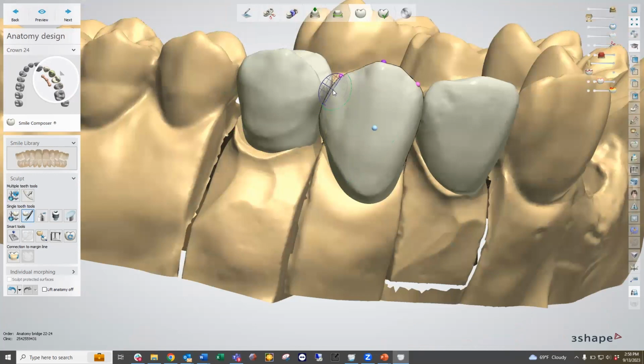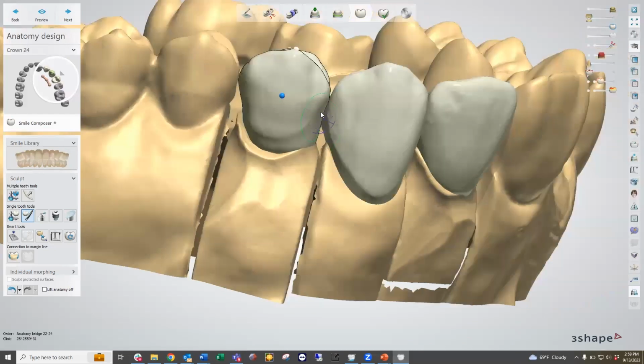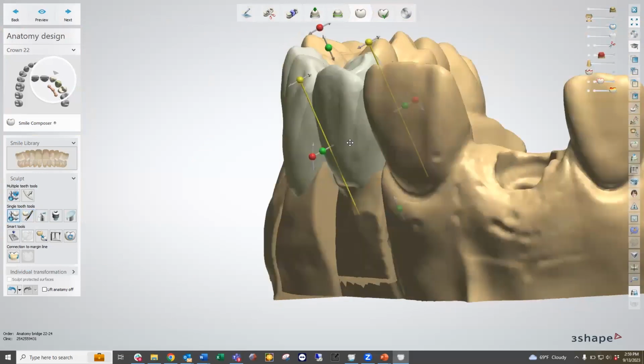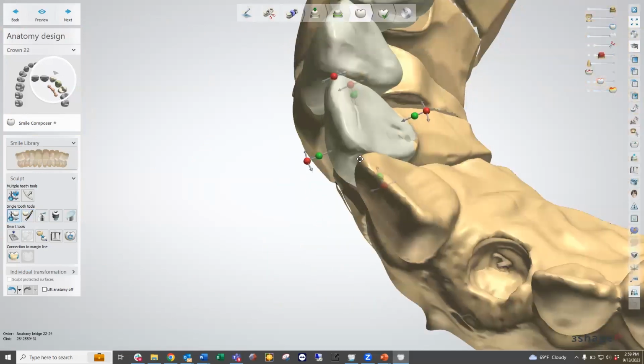So I'm going to develop this a little bit more with my medium change tool, or intermediate change tool, which is the morphing tool. This allows me to suck in or suck out certain areas of our design to encapsulate those median changes. Maybe suck this out, maybe tuck this one back in. Maybe it's too far. No, it's actually looking pretty good there.